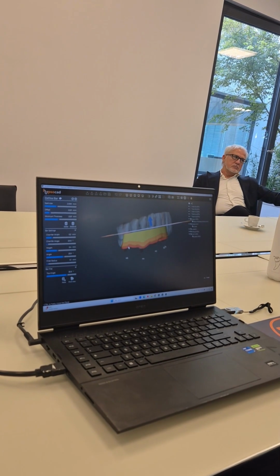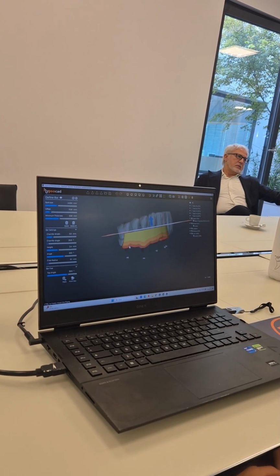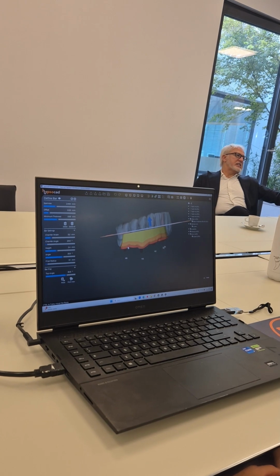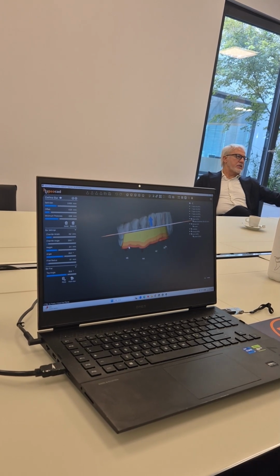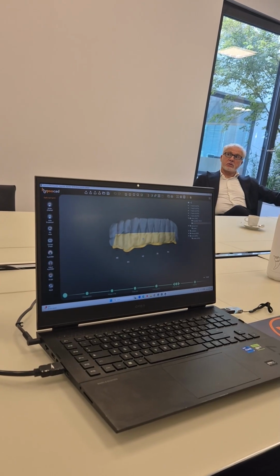And I imagine that you made some tests internally before to have the perfect check. Yeah, sure. This is exactly our job, to check every day if it works. Because this is a big pain for dental technicians. Yeah, we know that.